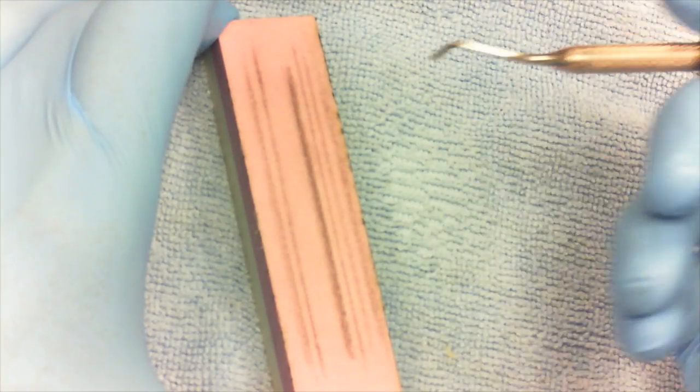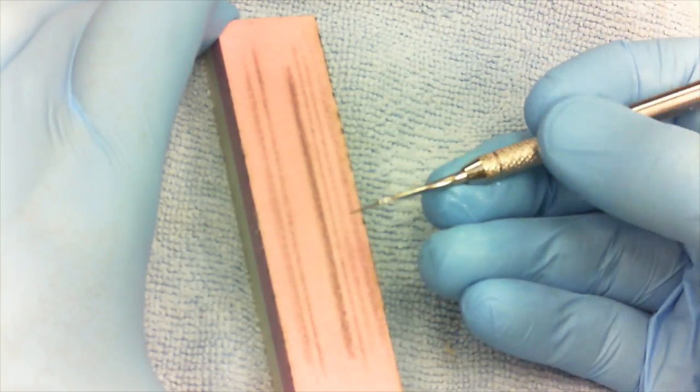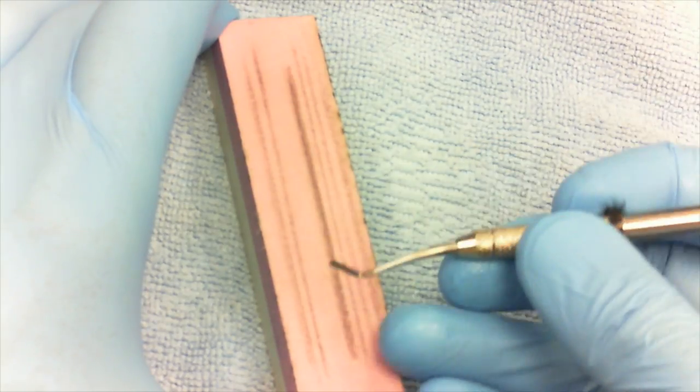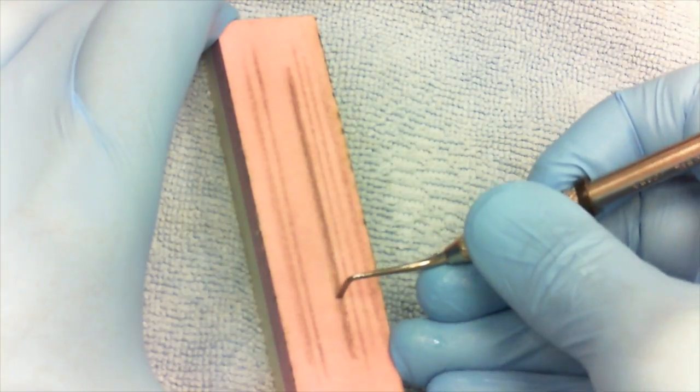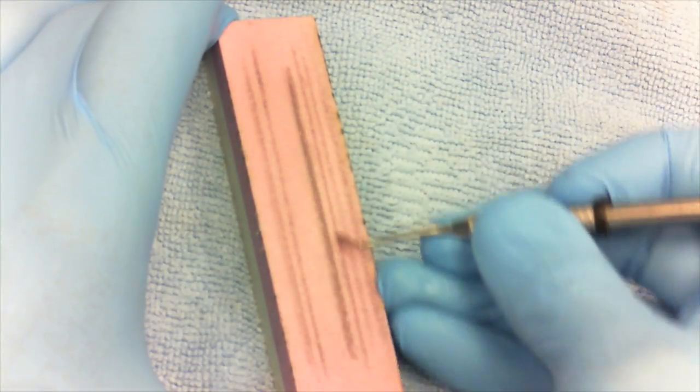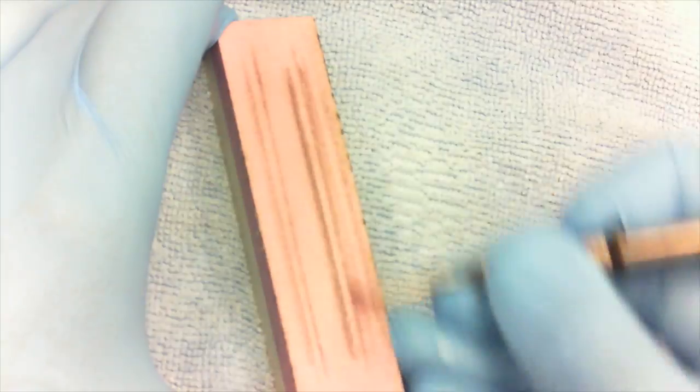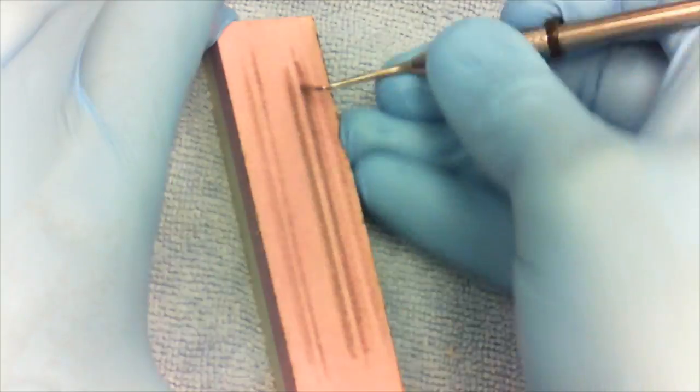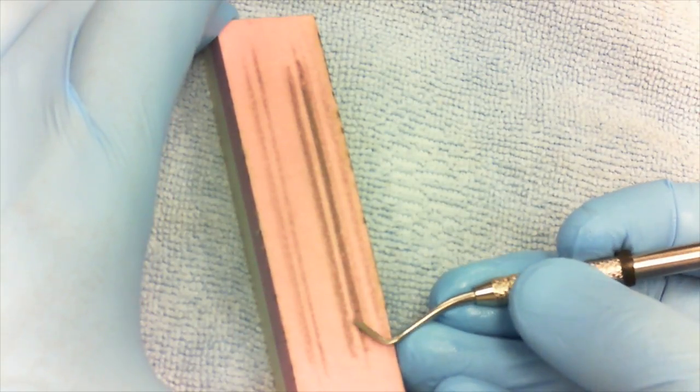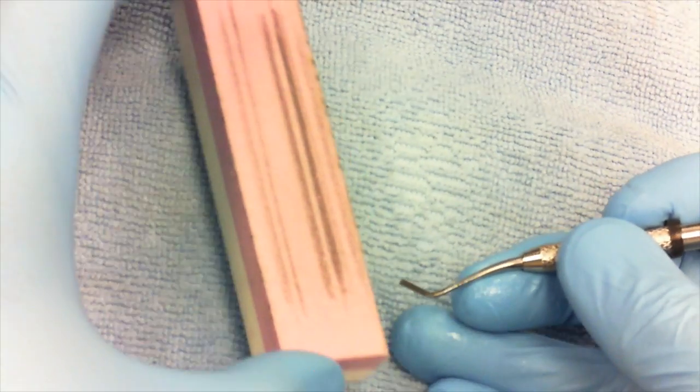When you're sharpening the other side, once again identify where the bevel is. We're going to hold the instrument up, tip it back 45 degrees, and now we're going to be doing a push stroke.